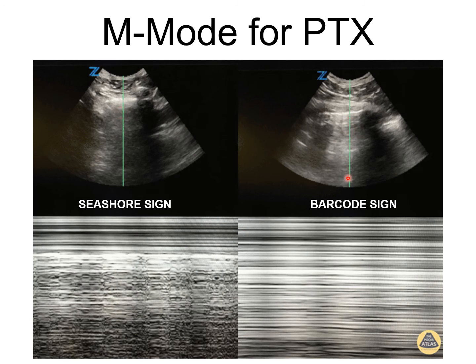As opposed to this image, where the subcutaneous tissue, the muscle, the pleura, and everything below it are staying exactly the same over time, and that means there's nothing moving here because there's a pneumothorax. Pleura has peeled away, and this is empty space that doesn't move with respiration.